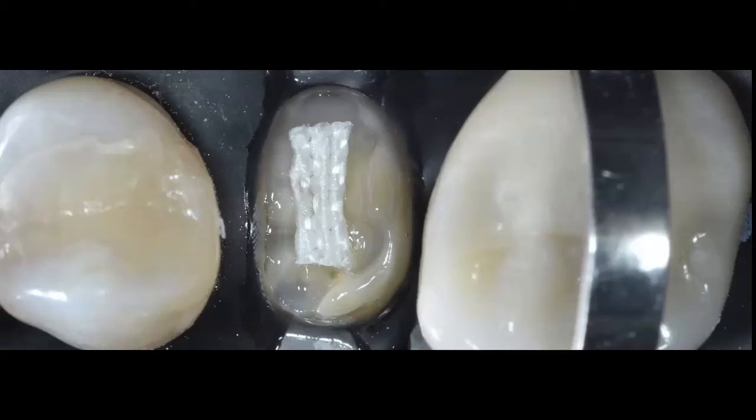If you have less tooth structure and you can prepare more of your pulp chamber, you may want to sink your fiber maybe 3 millimeters within that pulp chamber, or you may even remove 3 millimeters of gutta percha from one of the canals, and you can stick your fiber in one of the canals first, and then use another fiber to do the wallpapering technique, and in that case use 2 fibers. There's multiple ways that you can do this, but I felt comfortable doing it for this particular case following this technique that you're seeing right now.